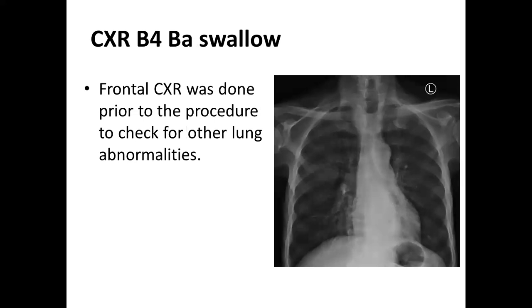And this was the X-ray, which was done blindly. Unfortunately, we don't have a fluoroscopy machine at our hospital, so we do these examinations blindly. So this was a frontal X-ray for the patient who presented with difficulties in swallowing.